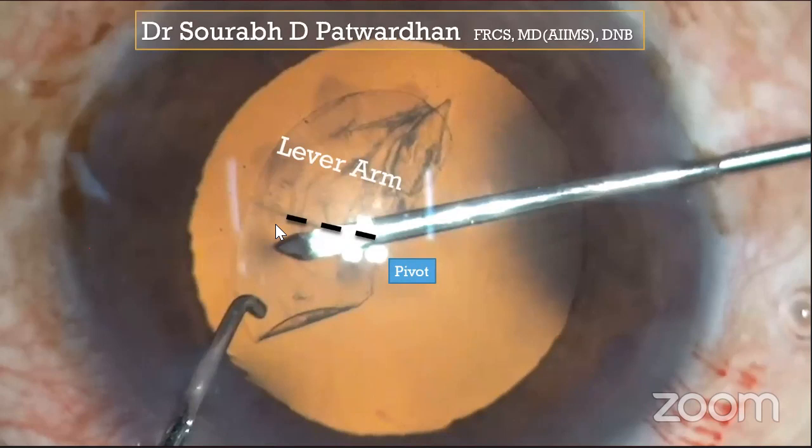So I advise my trainees to hold the flap at the outer one-third and inner two-thirds junction, because that is the point which gives maximum control and there is no risk of creating unnecessary small tears at the rhexis edge. So this is the best point to give you better control over the capsulorhexis.